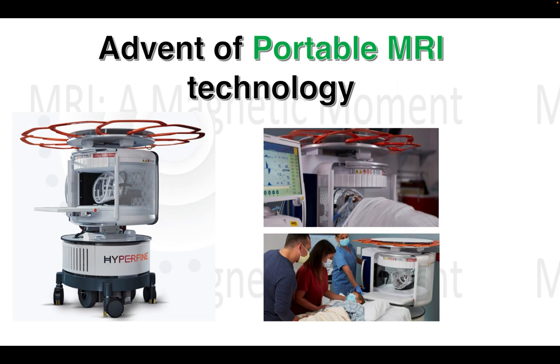So this technological advent, MR imaging portability, is workable in environments like the ICU and ED, emergency department, where patients are often intubated, connected to life support equipment, and otherwise surrounded by metal objects. So, overall, a great advancement in imaging technology, considering the limitations of metal and magnet interaction and safety issues that we will discuss in future modules as well.